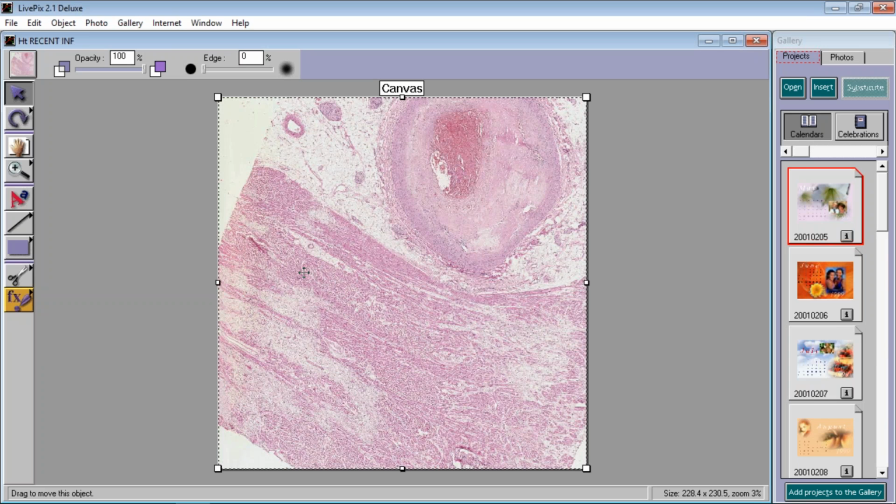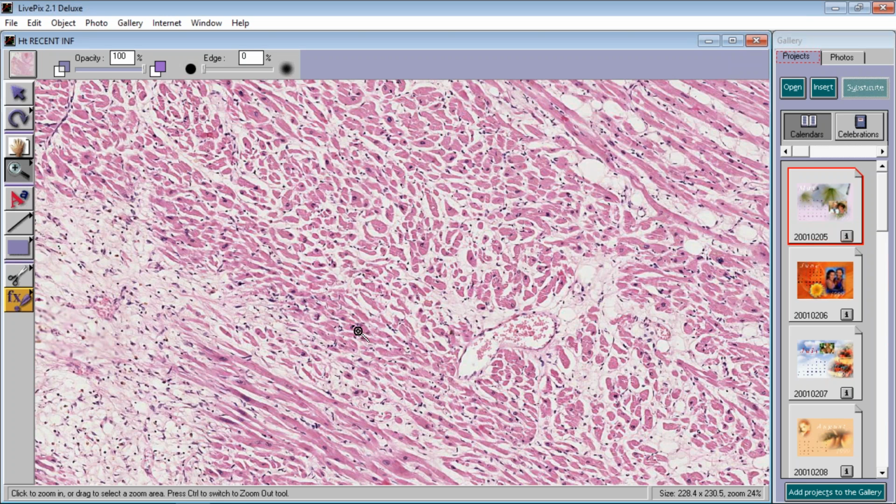And once again, first of all, you see an artery in the epicardial fat pad that looks like it's almost thrombosed, or perhaps 90 or more percent occluded. And then you can see some muscle fibers, but there's some white stuff in between too. Here's some fibers cut longitudinally. Here's some fibers cut on cross-section.